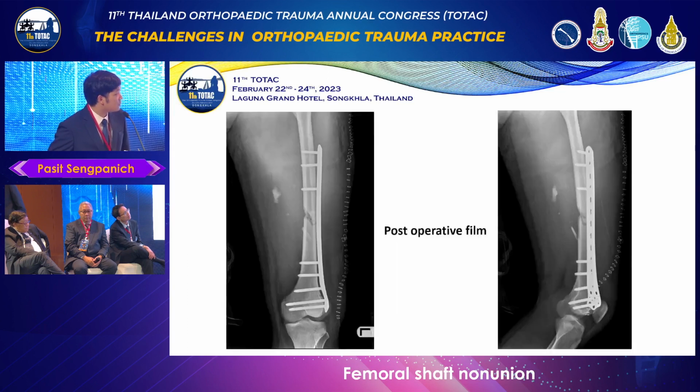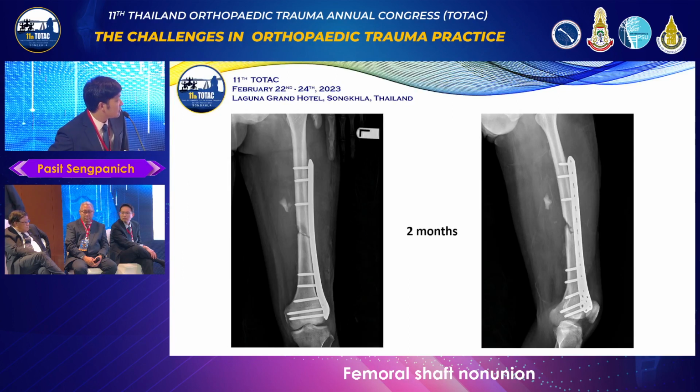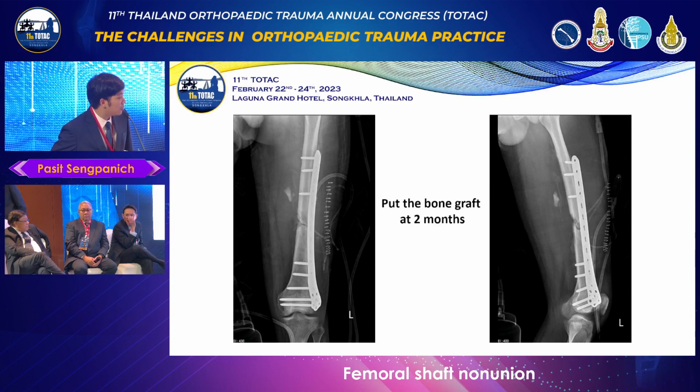And this is the post-operative film. And then they followed up at 1 month. This is a film at 1 month, and then 2 months. At 2 months, as we can see, the fracture still has no callus. So the surgeon performed a bone graft on the fracture site, and then they still followed up.